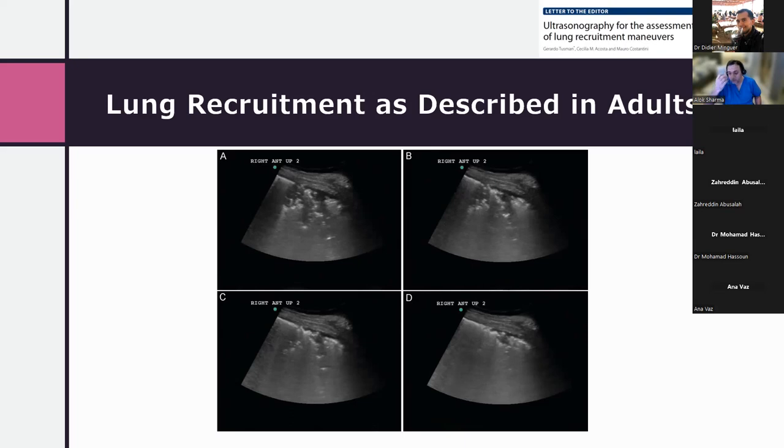If you have invasive arterial monitoring and you find that your blood pressure is starting to drop, but also looking at your heart and filling, and if you find that the right side of the heart is really starting to struggle, your right atrium is starting to collapse, then these are all signs that you use in conjunction. And this is why I would say to you that in a novice hand, this can be very dangerous and counterproductive. I have seen pneumothoraces happen. I have seen situations where venous return decreases to the point where blood pressure is not good and your lactates are starting to go up.